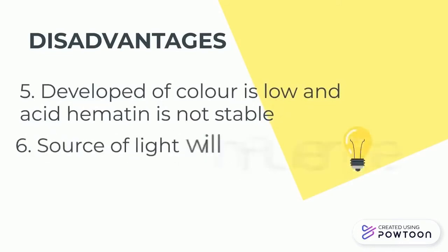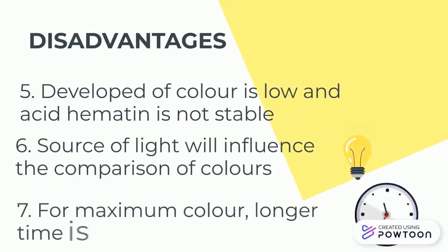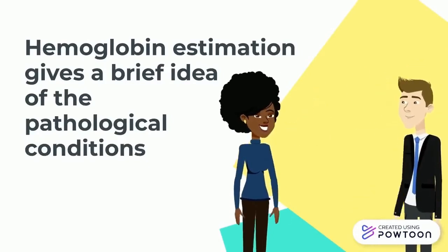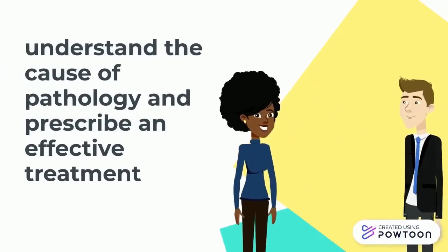Source of light will influence the comparison of colors. For maximum color, longer time is required. Hemoglobin estimation gives a brief idea of the pathological condition to the physician so that the physician can easily understand the cause of pathology and prescribe an effective treatment for it.